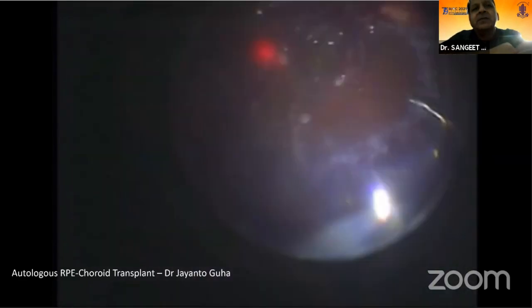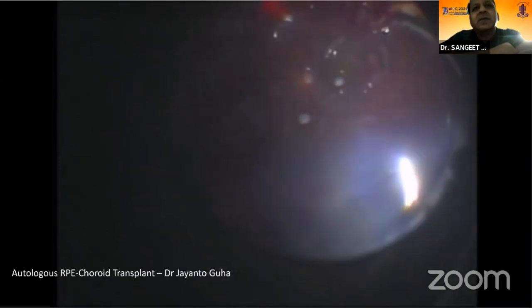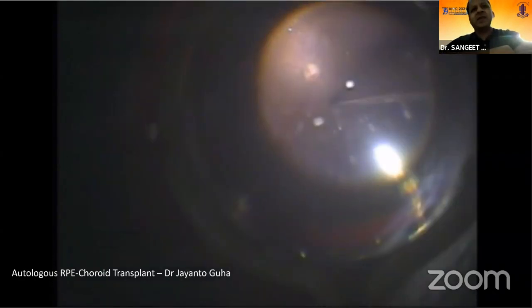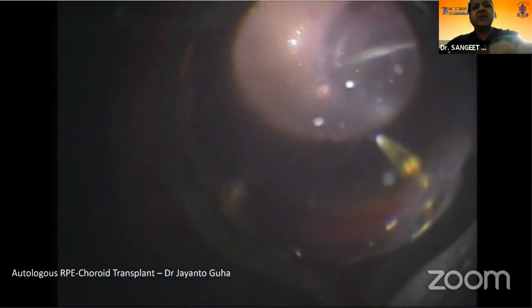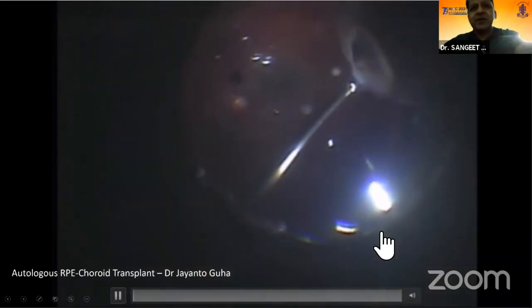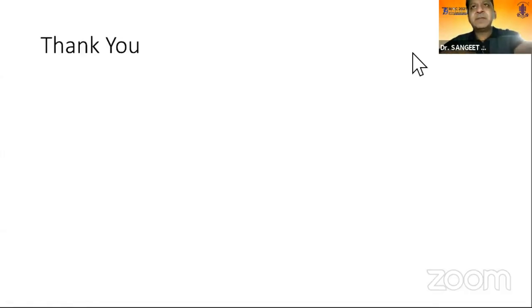And the laser is done, and silicone oil is then used as a tamponade. So this is his technique of doing autologous RPE choroid graft.